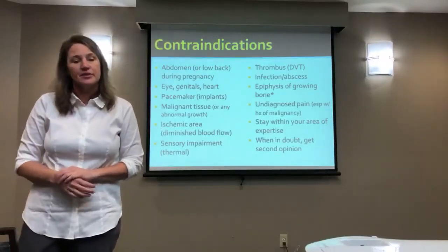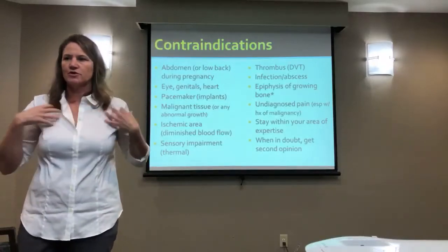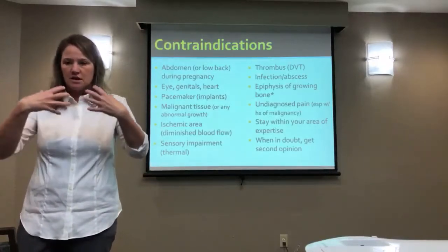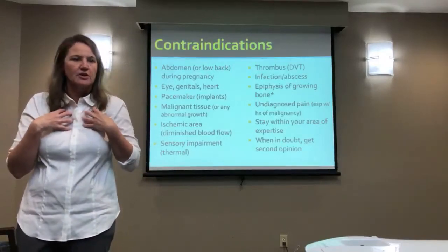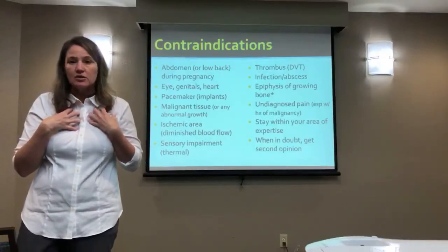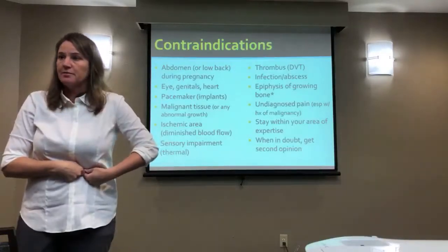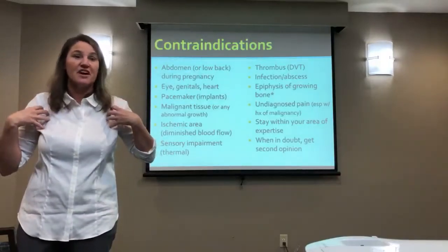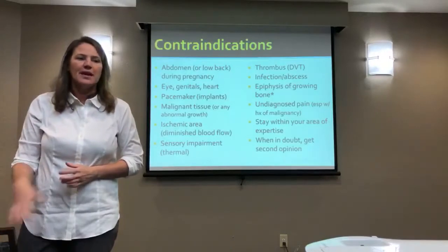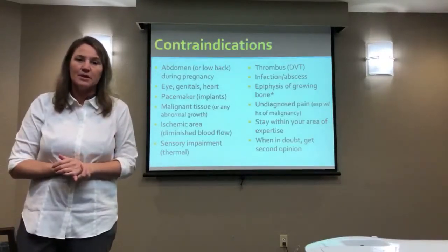The heart, you couldn't get to the heart if you wanted to. You could ultrasound over someone's chest wall and it's not going to penetrate past the bony fascial layer here. And actually the way they look at a heart is either esophageal down through the esophagus or below the ribs and up. So again, stick to what you know. Ultrasound of the musculoskeletal system in the chest wall is fine.